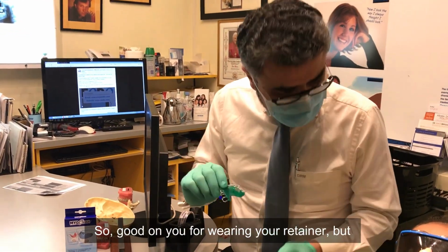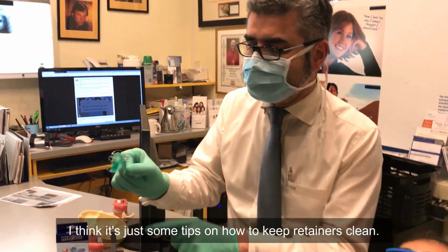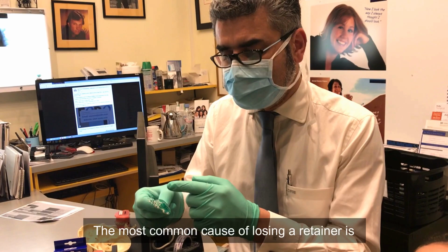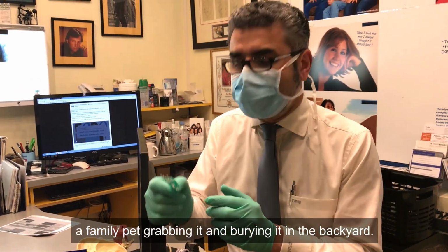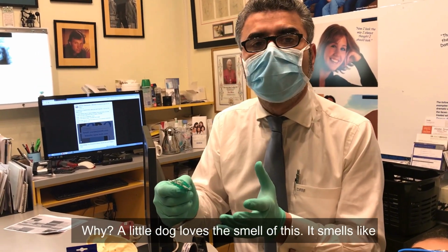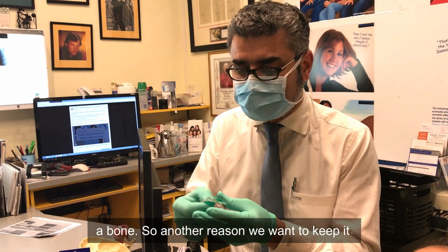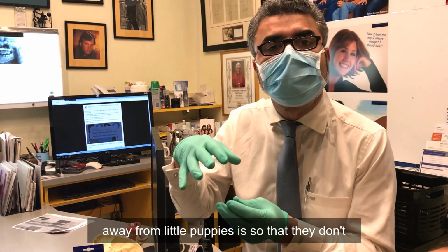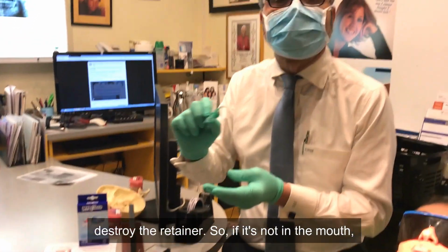So good on you for wearing your retainer, but I think it's just some tips on how to keep retainers clean. The most common cause of losing a retainer is a family pet grabbing it and burying it in the backyard. Why? A little dog loves the smell of this. It smells like a bone. So another reason we want to keep it away from little puppies is so that they don't destroy the retainer.